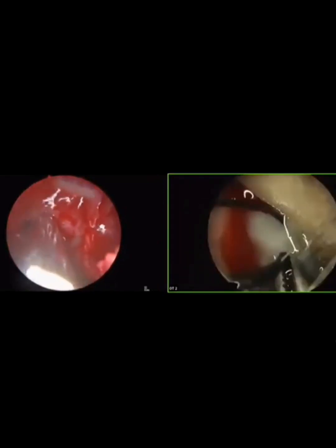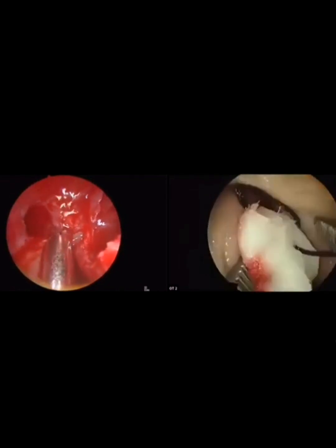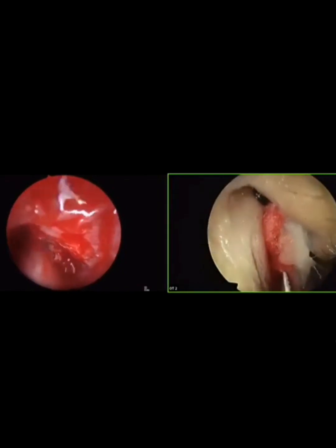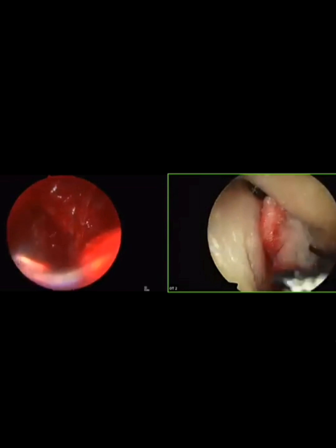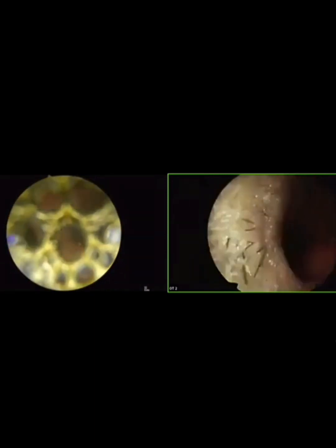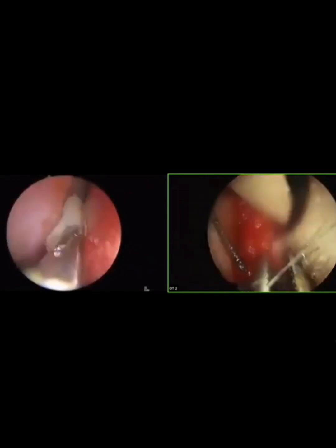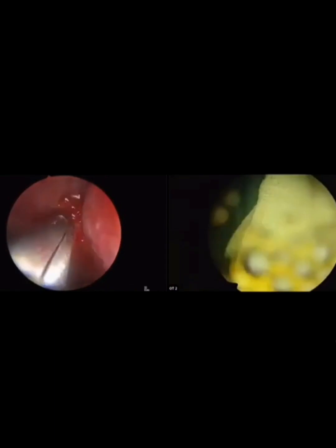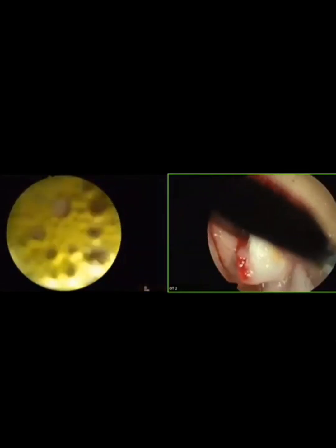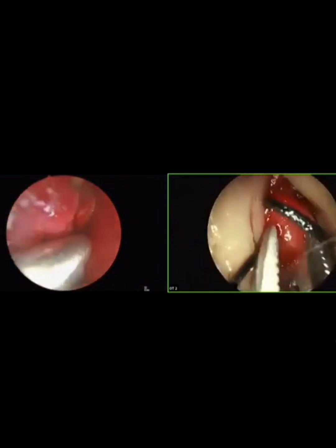Hello? Yes, hello, can you hear us? Just give us an idea what the case is and what the nasal endoscopy findings are. The patient is a 22-year-old male with a complaint of long-term left side nasal blockage. The patient has DNS to left. I've infiltrated on the left side of the nasal septum, and this is the right side. We are still to infiltrate on this side. Any special method of infiltration, any spinal needle? No, we use a normal 26 gauge 1.5 inch needle, and the patient is young, so we use the prepared xylocaine with adrenaline solution.